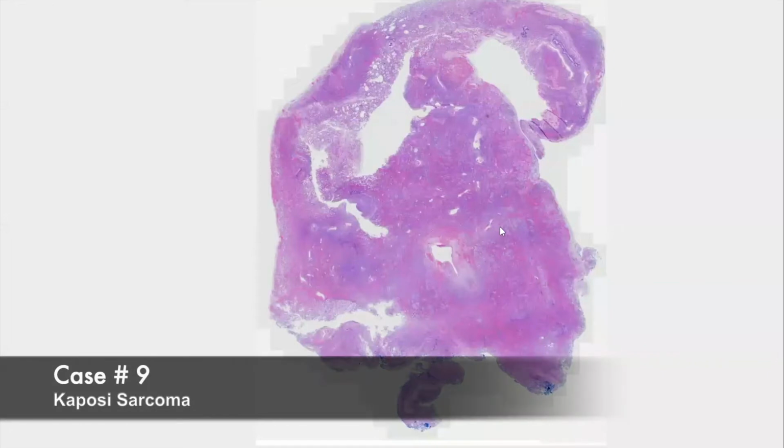So our next case here is a surgical resection. You can see it's fairly abnormal even at this low power, where we start to see these quite cellular areas. And we do see a lot of blood as well.